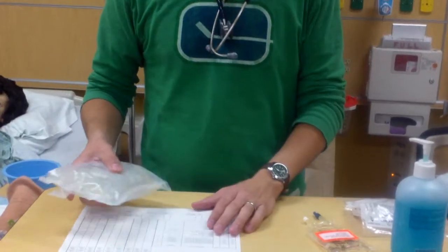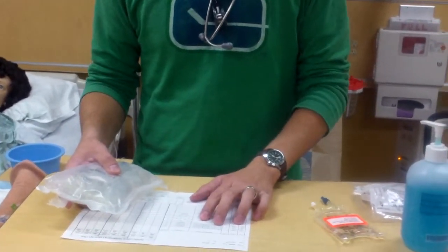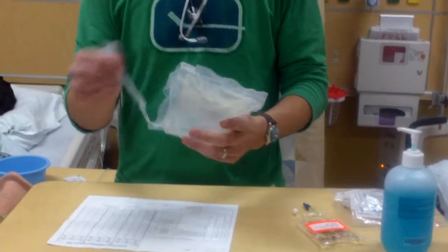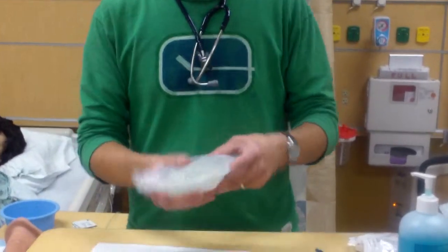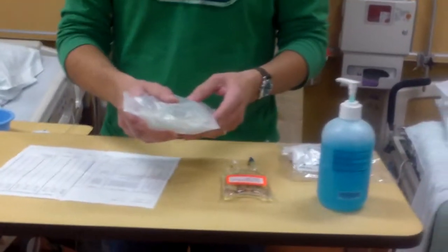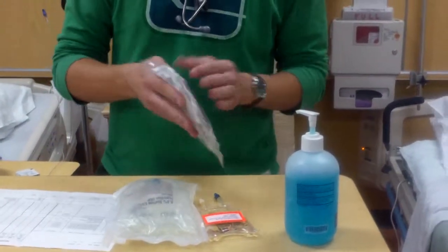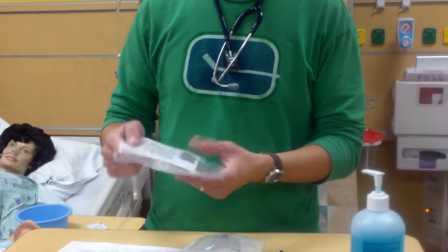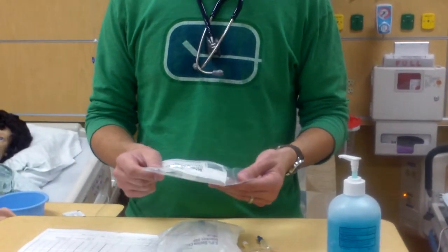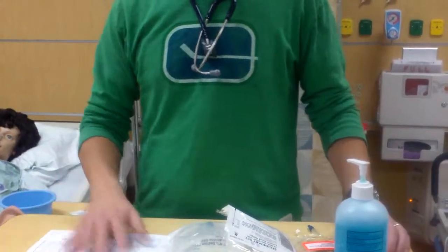So then my second check for my sodium chloride, the right patient, time, route, dose, medication, it all matches up. Integrity of the package is good, okay, so it's good. And the expiration date on both of these are good. This was prepared today, this one still is good. So then I have all my equipment. I also need a secondary set for my piggyback, checking the quality of the package and the expiration date. It is good. So I'm going to take all my equipment to the patient's room with my MAR.